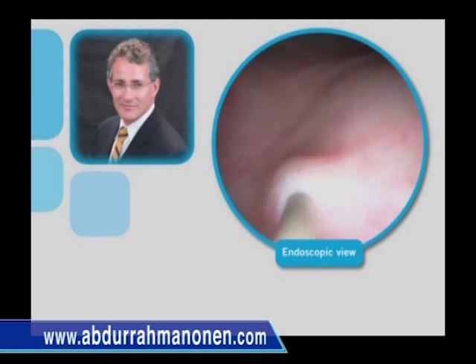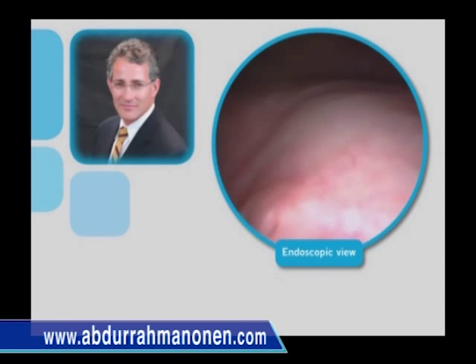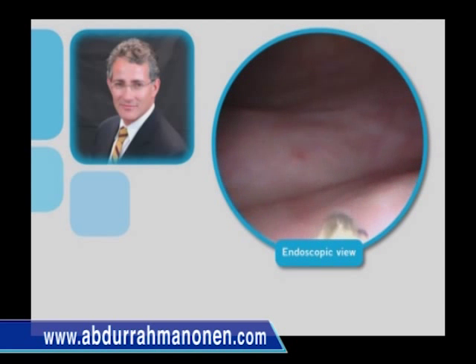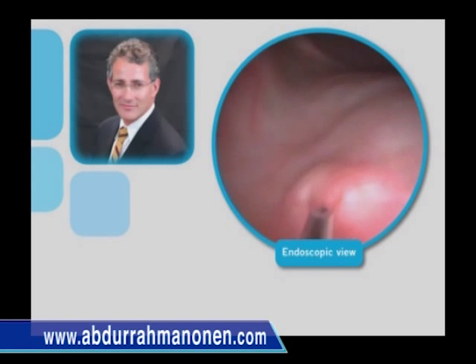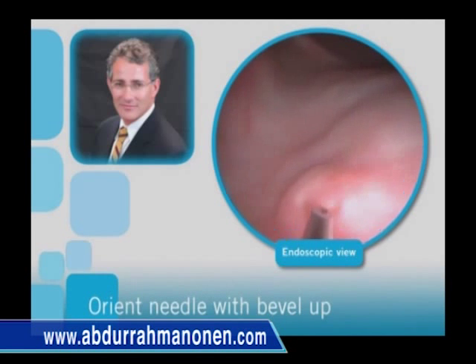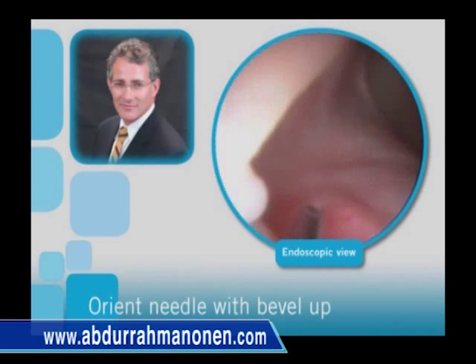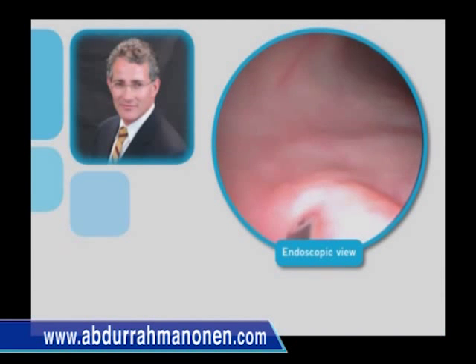It would be unusual for treatment of a lower pole to lead to reflux of an upper pole. However, in our experience, we have seen this occur on several instances. The needle for injection is passed into the lower pole ureter under direct visualization.